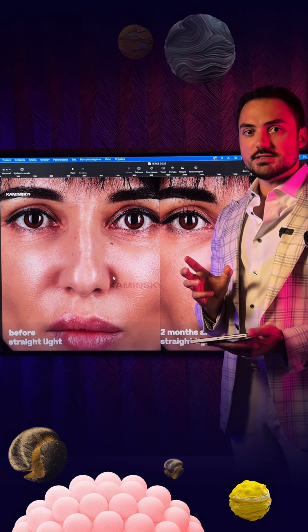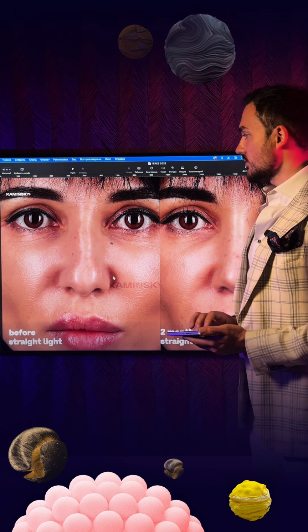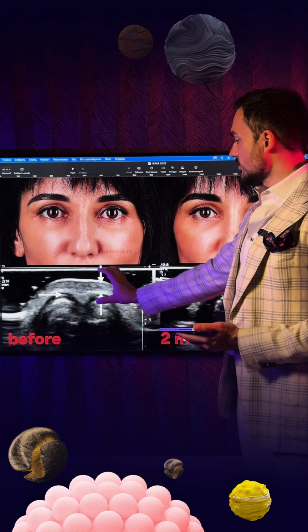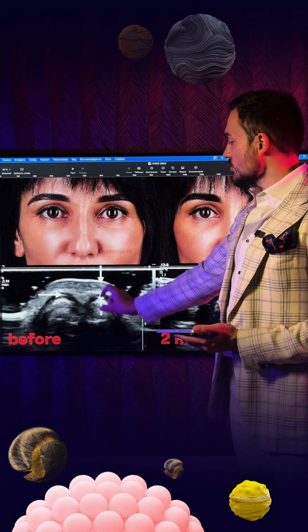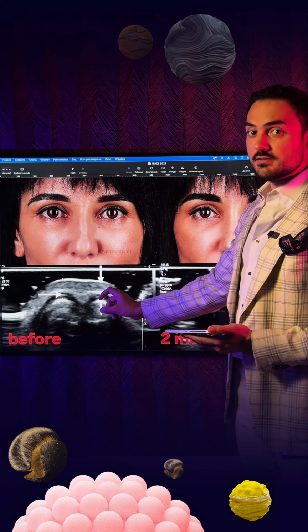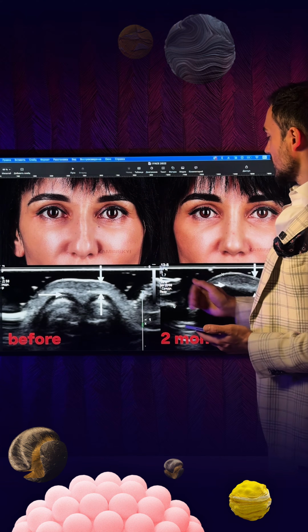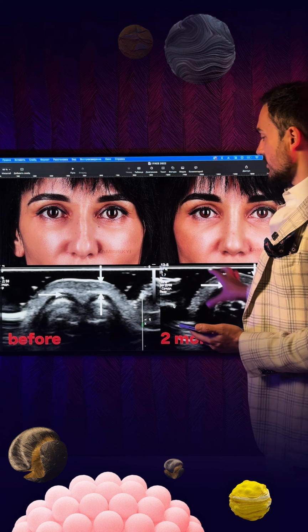What can help us to understand when we have the final result after the rhinoplasty? The answer is ultrasound examination. When we do ultrasound examination before and after the rhinoplasty, we can measure the thickness of the layers of the skin and also the thickness of the layers above the cartilages. And after the rhinoplasty, we can compare the layers before and after.